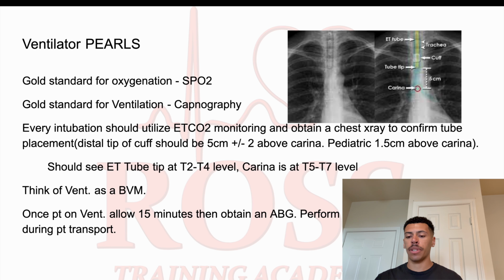You're going to look for the distal part of the tube, the end of the tube, to be about 3 to 7 centimeters above the carina. For pediatrics, you're going to look at the end of the tube being 1.5 centimeters above the carina.